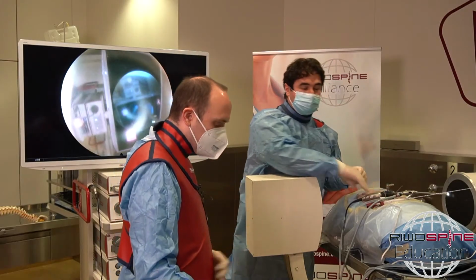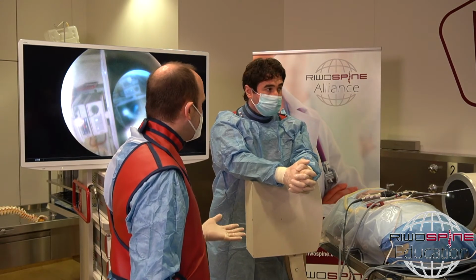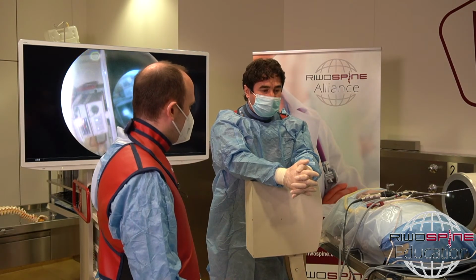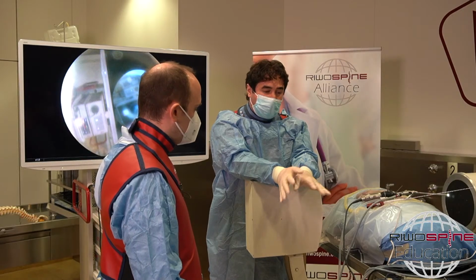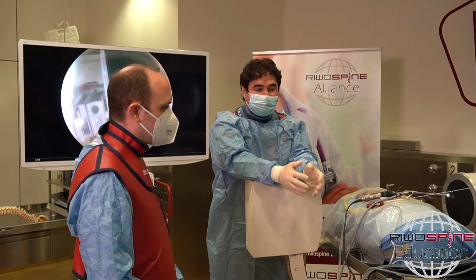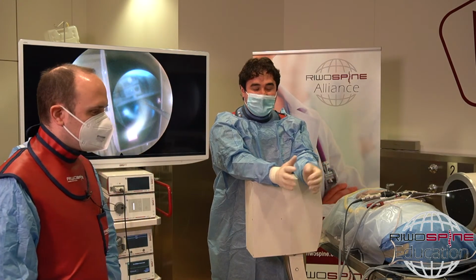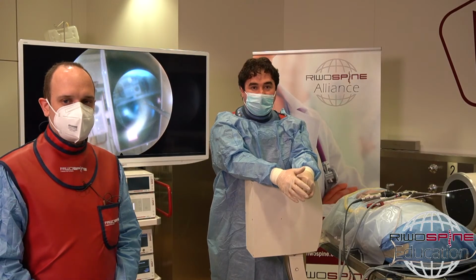One more question. Can we use indigo carmine in the interlaminar technique to stain the disc? If the disc fragment is far caudally migrated, especially, we explore everything, we see what we have in front of us, then we don't need indigo carmine for this.